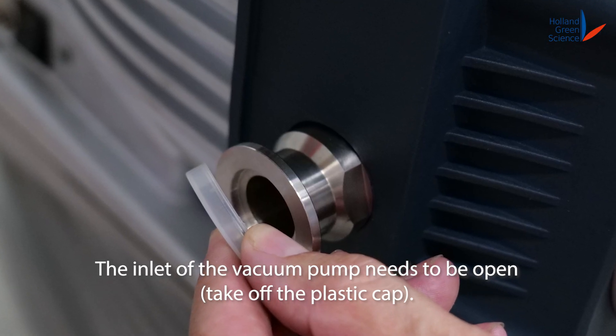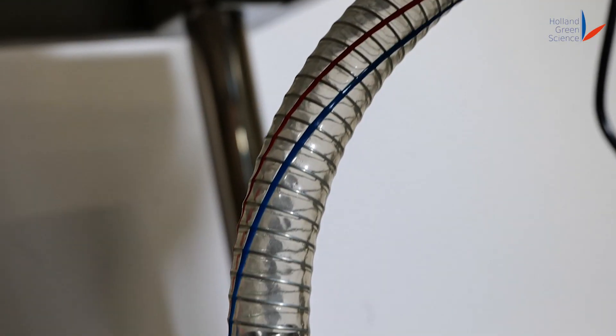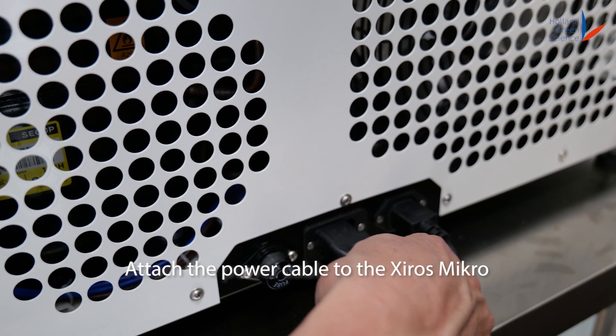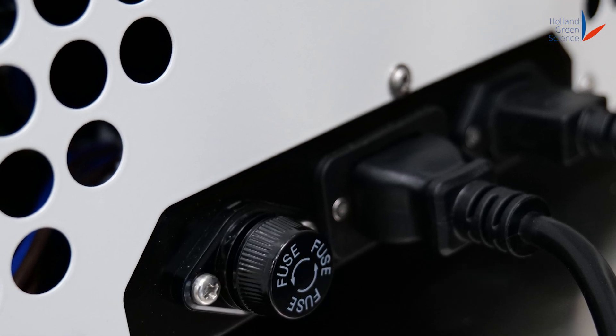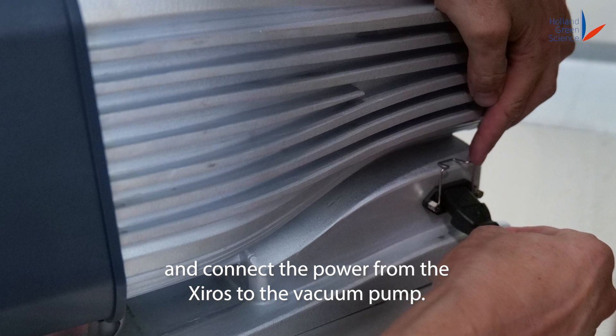The inlet of the vacuum pump needs to be open. Attach the power cable to the Xiros Mikro, and connect the power from the Xiros to the vacuum pump.